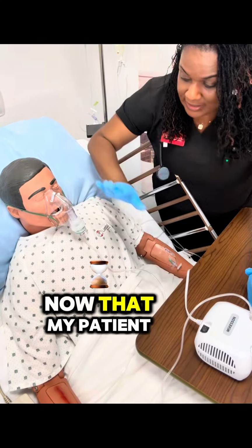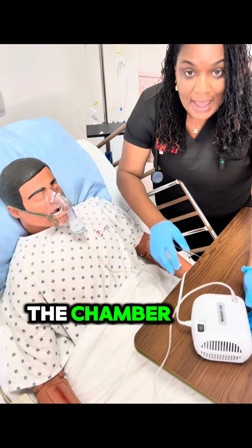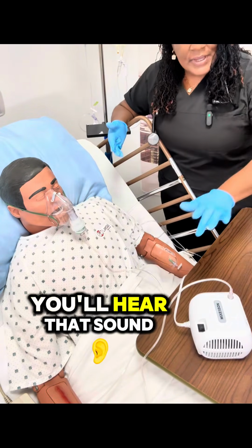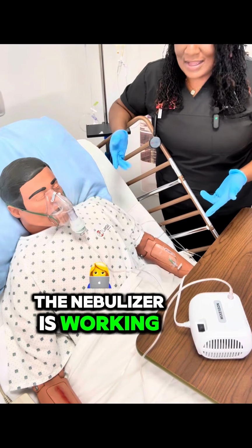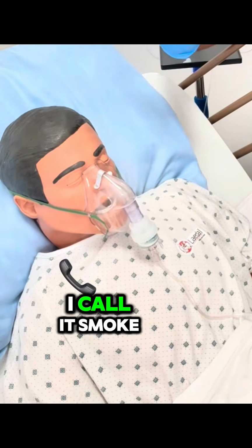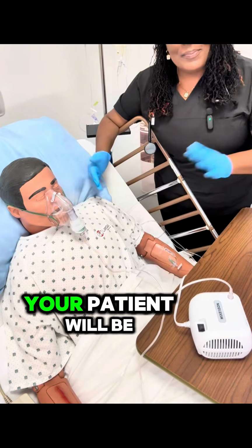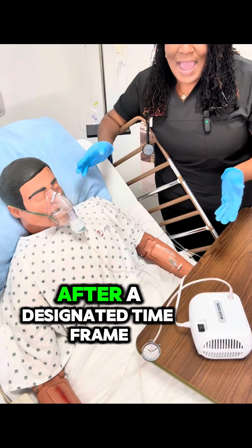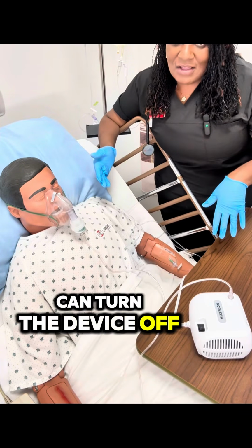Now that my patient's sitting upright and the medication is in the chamber, I'm going to turn on the compressor, and you'll hear that sound that will indicate that the nebulizer is working, but you'll also start seeing the smoke. I call it smoke, but it's a mist that's coming out. Your patient will be breathing normally, and then once the mist has stopped, or after a designated time frame, about 10 minutes, you can turn the device off.